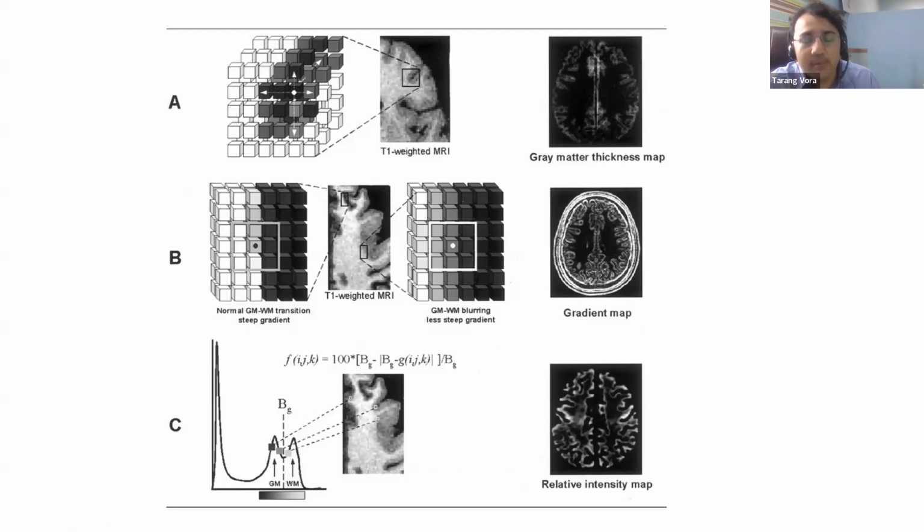For the computer to be able to do it, it needs a set of normal data. So there is a set of around 100 patients with normal gray white matter junction and voxel frequency and density, and that is compared with this. So in texture analysis, we are comparing the intensity of the signal. First on the image is the gray matter thickness map. It will look at how thick the gray matter is, whether it is too thick compared to average or it is normal thickness. Second is the gradient map.